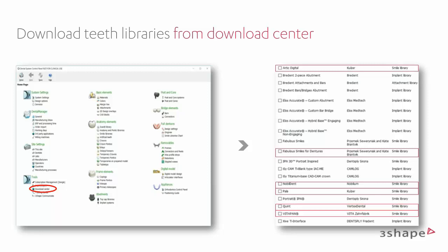In the new version, can you go straight to the setup stage on a case that you already made, like going back to tweak a setup? So do you mean that you open an already designed case and then you go straight to the stage? No, this is what we discussed.